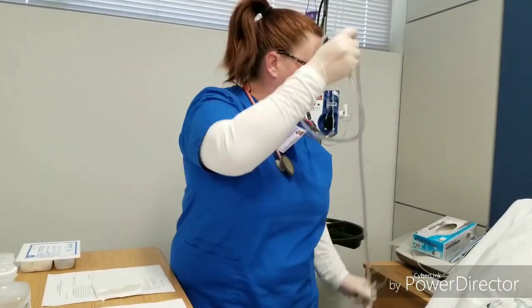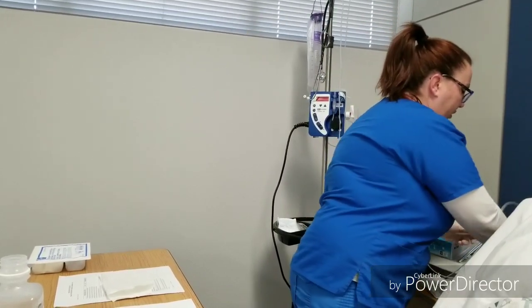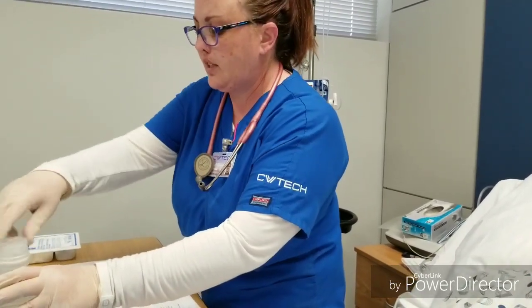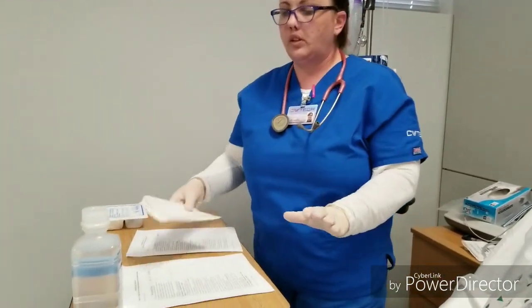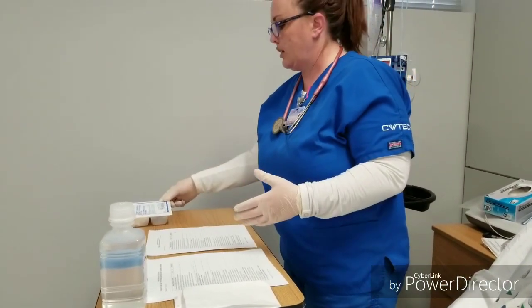Okay, now we're going to get ready for trach care. For trach care, it is a sterile procedure, so same thing applies. You'd want to have sterile gloves and always have 2 pairs of sterile gloves with you in case you break sterile field and you need to reapply them real quick.